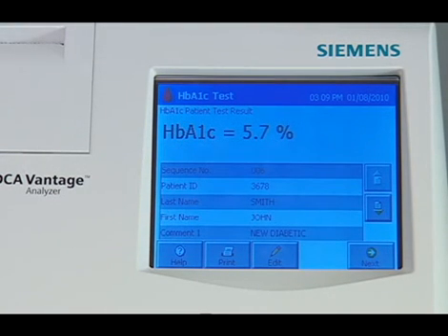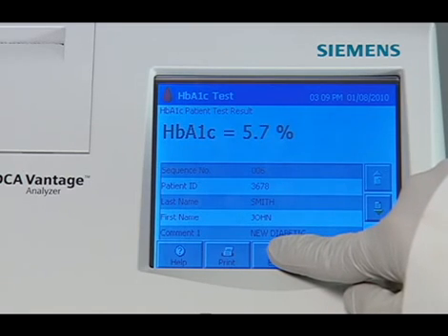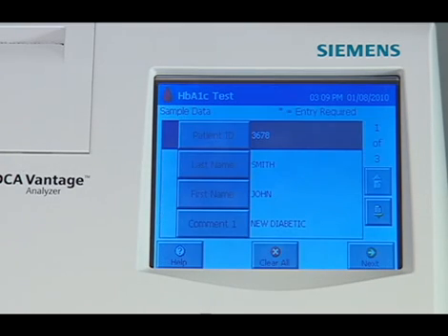The result screen displays when the system finishes analyzing the sample. The screen displays result values and demographics for each test. You can edit the sample demographics and comments at the sample data screen prior to printing by selecting the edit button. You can also print the result by pressing the print key.